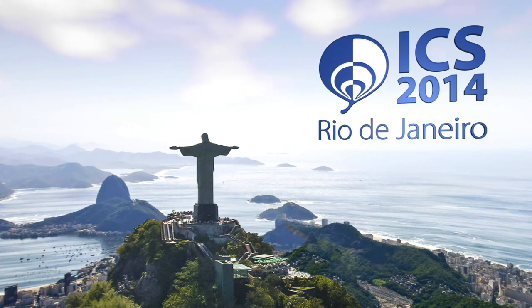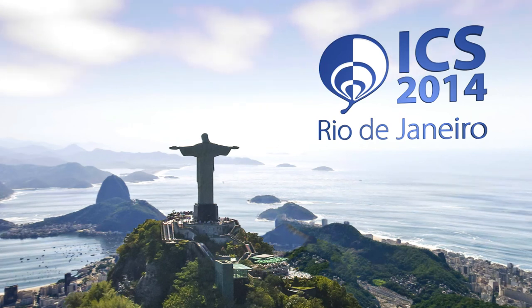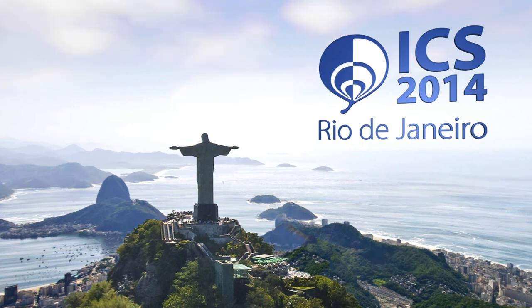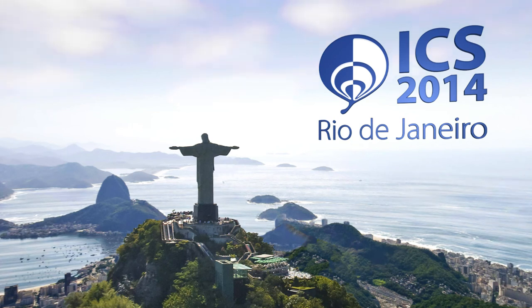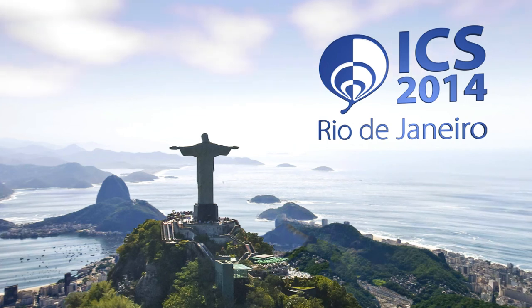Just from where you left off. Today, in female stress urinary incontinence, we are doing VLPPs just for academic purposes, but this does not change our treatment strategy. All of the index patients are undergoing mid-urethral sling surgeries, and urethral hypermobility is the real factor that we analyze. Did you think to combine VLPP with urethral hypermobility to find maybe a better prognostic factor for surgical outcome? Because we know that urethral hypermobility and VLPP are two completely different phenomena. But in patients with low VLPPs, the incidence of urethral hypermobility is higher. When VLPP goes up, it goes low.